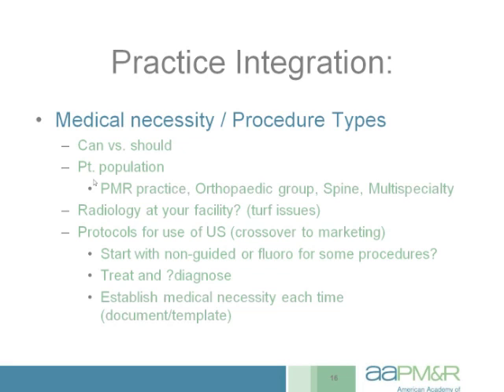So patient population is going to play a strong role in what kind of procedures you offer. As I mentioned earlier, I'm basically within an orthopedic practice, so I have a very strong referral base of musculoskeletal procedures, and I've worked closely with them on establishing protocols. I've also done a lot of lectures with the primary care physicians within my hospital in the geographic area, letting them know what musculoskeletal ultrasound is appropriate for and what it's inappropriate for.